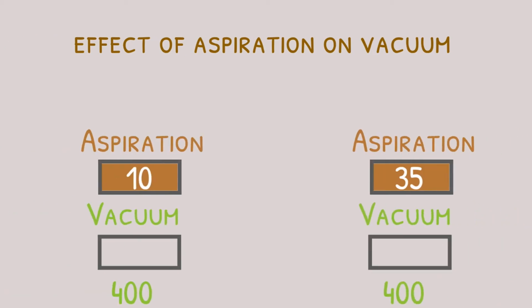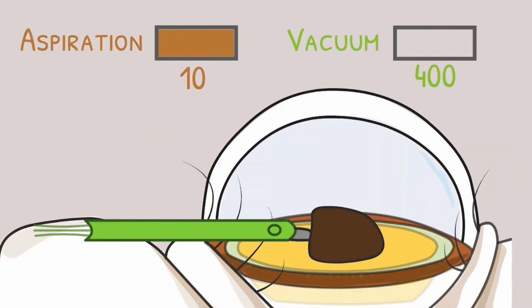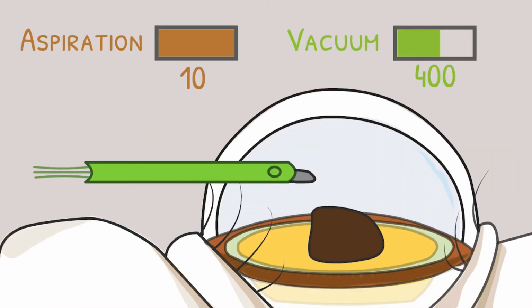And also here the vacuum rise time: poor holdability because of low aspiration flow rate, and the time needed to reach maximum vacuum is also very long.